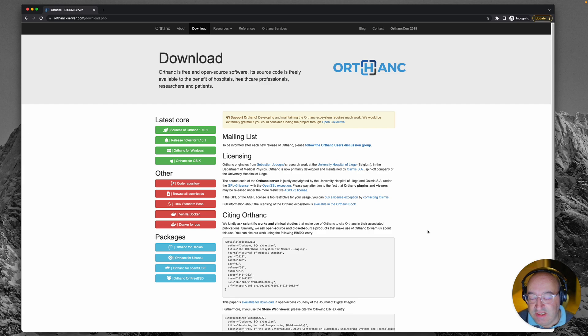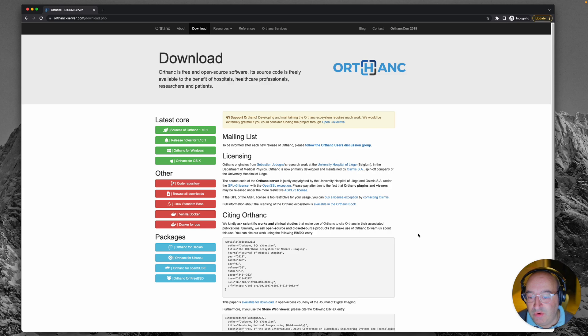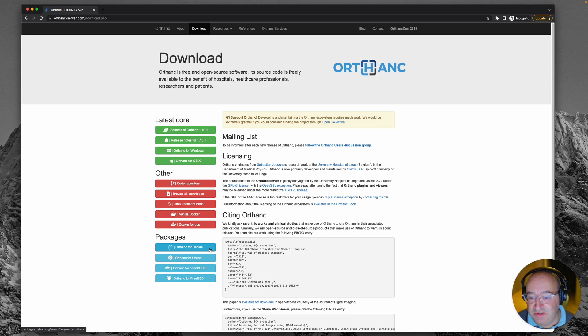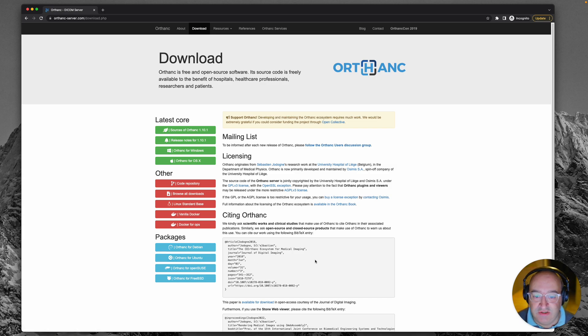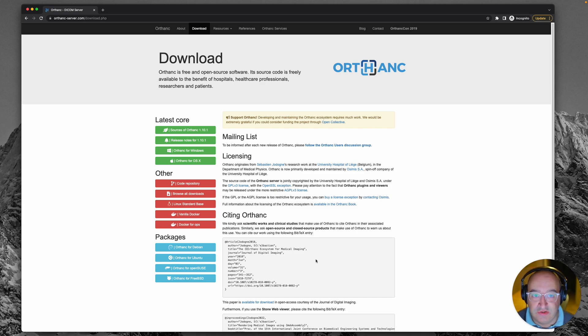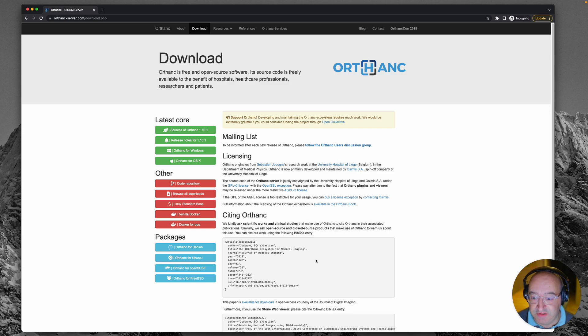But when you're trying to do it in a server situation like I am, things do get a bit more involved and we have to go for one of these Linux installations such as Orthanc for Debian or Ubuntu. I'll be using the Ubuntu installation as it is one of the most commonly used operating systems for servers.